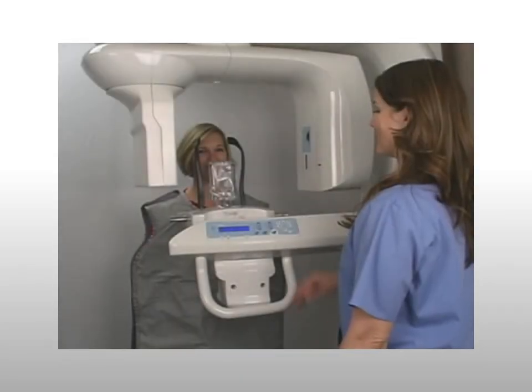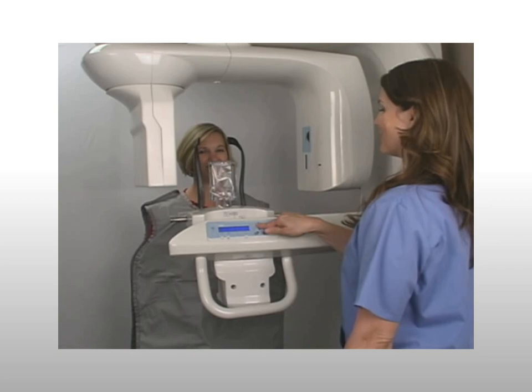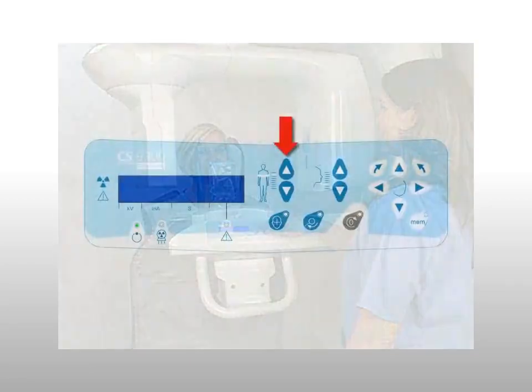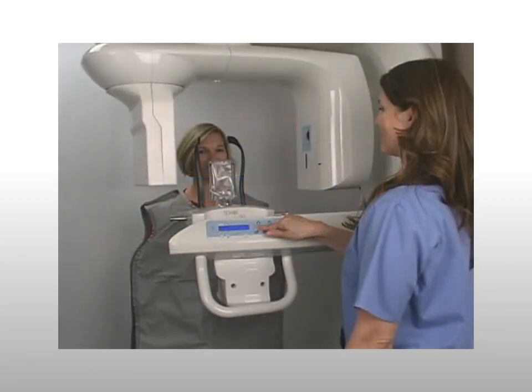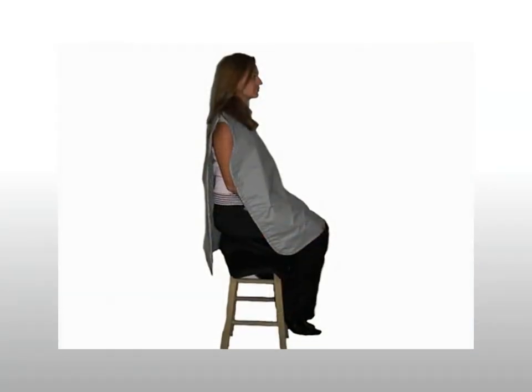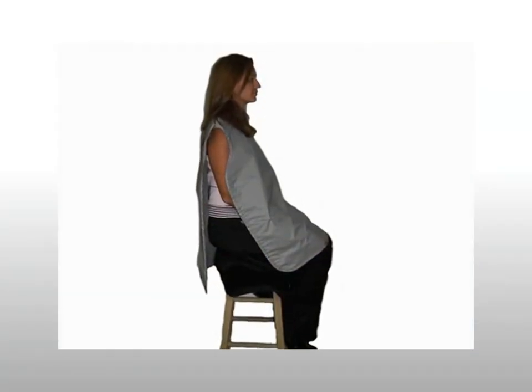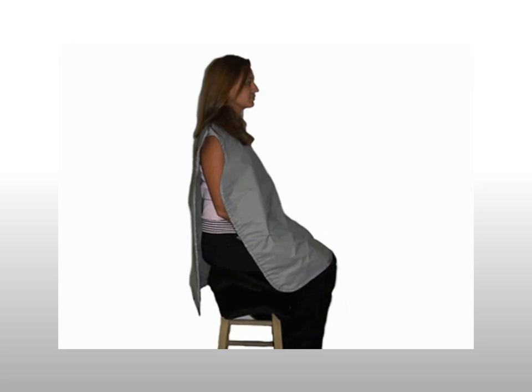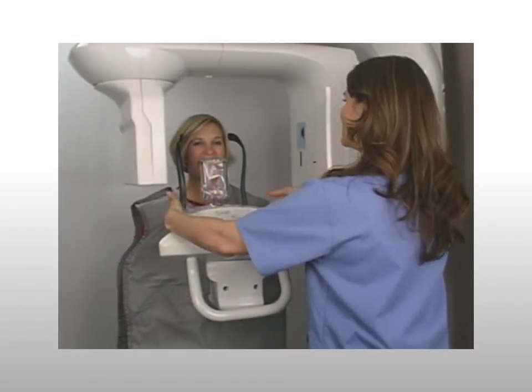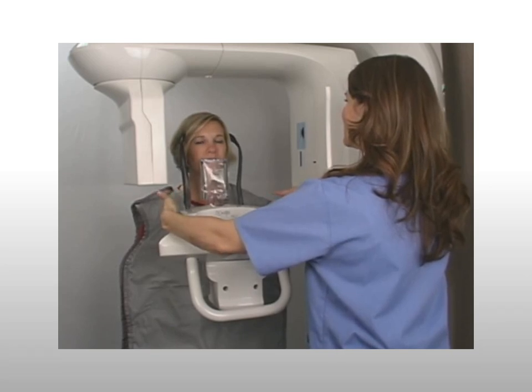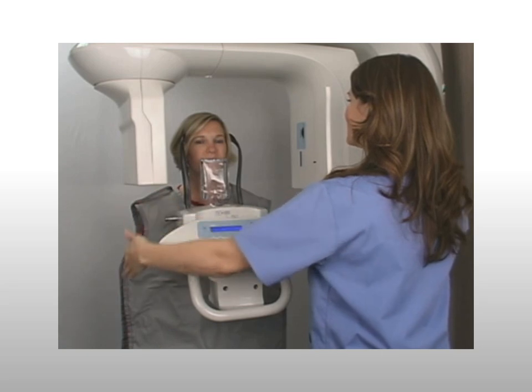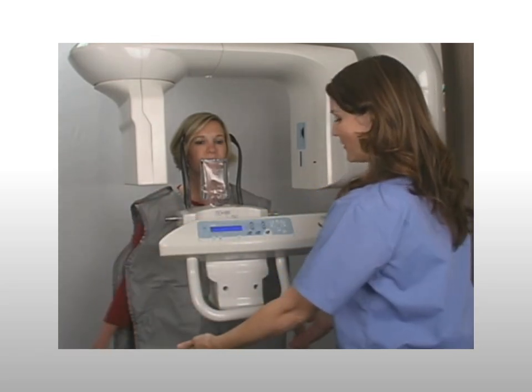To adjust the machine to the patient's height, use the height adjustment button to move the machine up or down to enable the patient to comfortably bite on the bite block. If the patient is tall, have the patient sit on a stool and adjust the machine accordingly. After the machine is at the correct height, open the temple supports and instruct the patient to step forward and close on the bite block.